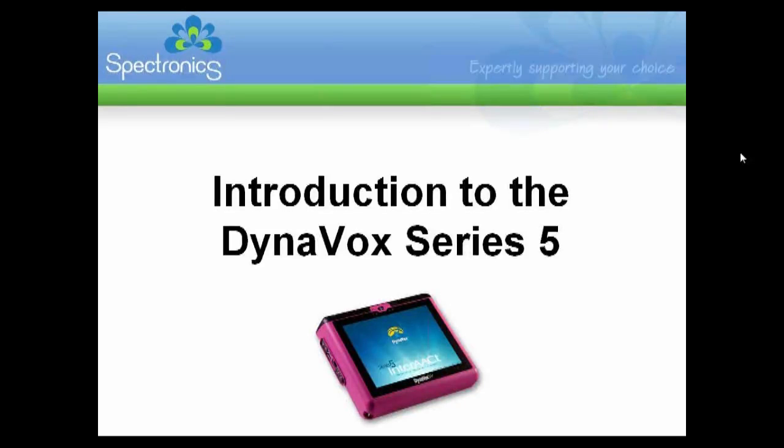Hi, welcome to this introduction to the DynaVox Series 5 software. I'm going to be going through this webinar with you to talk to you a little bit about what the software is and how you can use it.